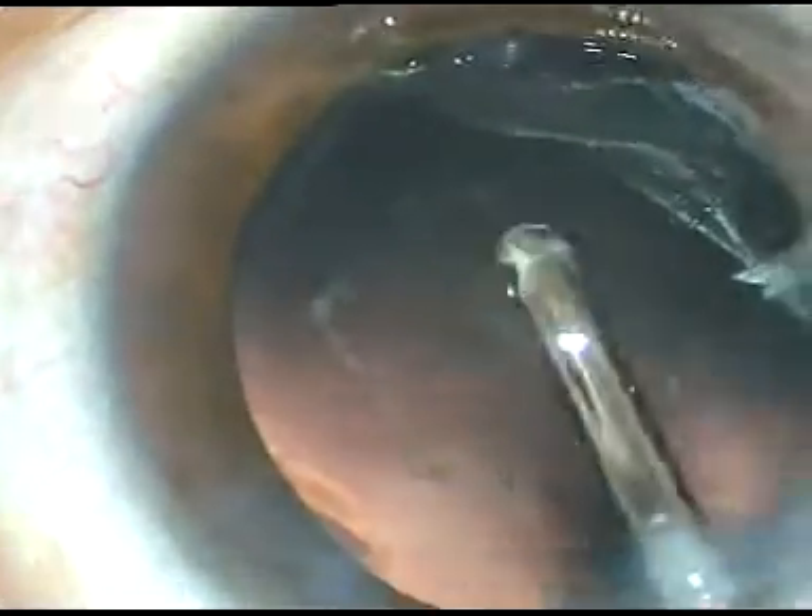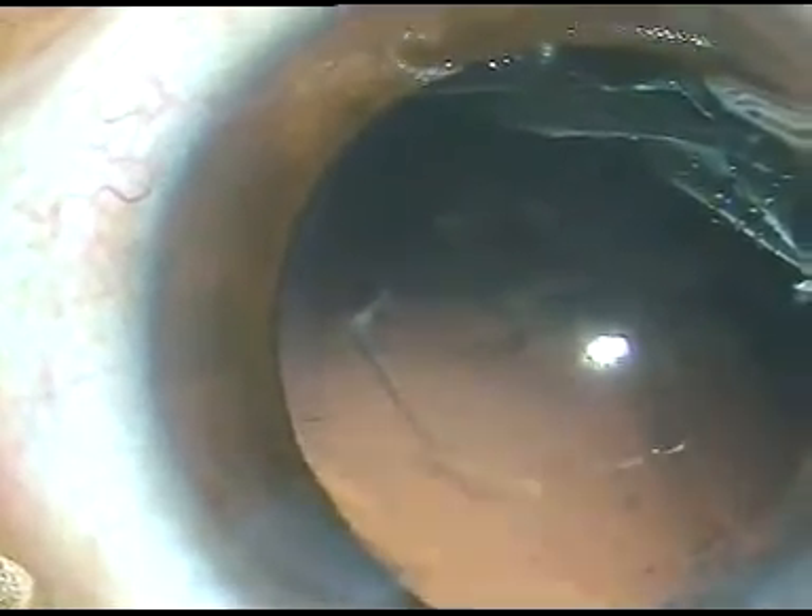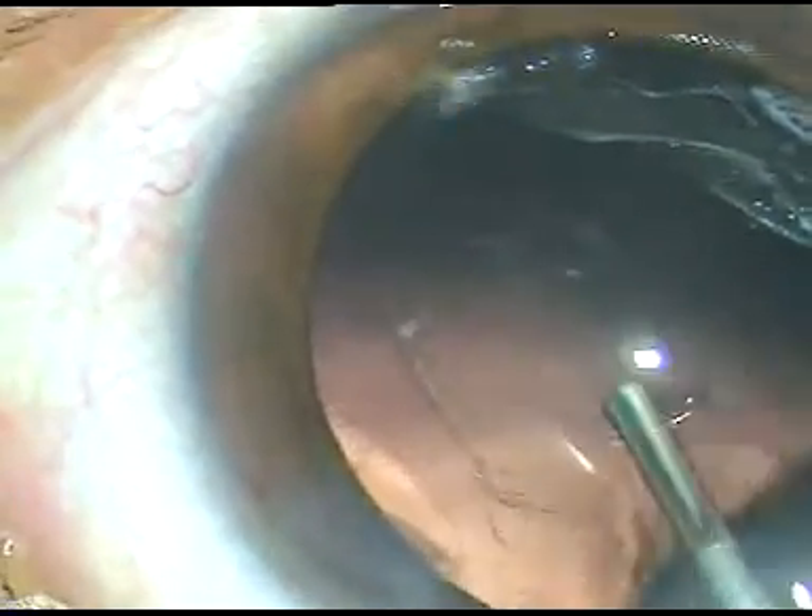In this case, I have selected a Hoya intraocular lens — it's a hydrophobic intraocular lens. I have been using this lens for the last three years and haven't seen any glistening till now. This is the most beautiful, most elegant preloaded system in the industry. It is compatible with a 2.2 mm incision, and if the incision is 2.8 mm, it goes into the anterior chamber easily.